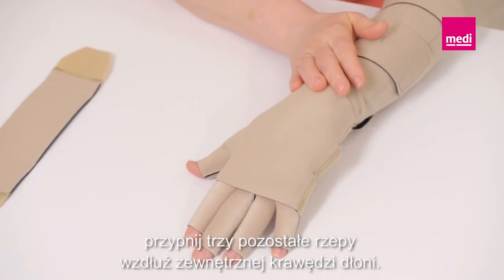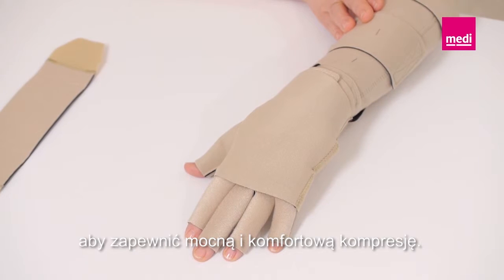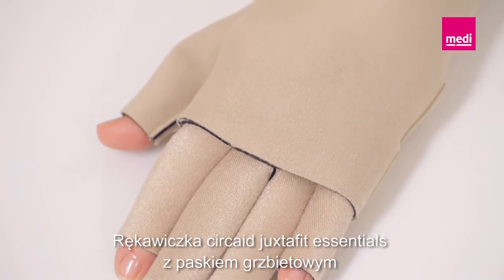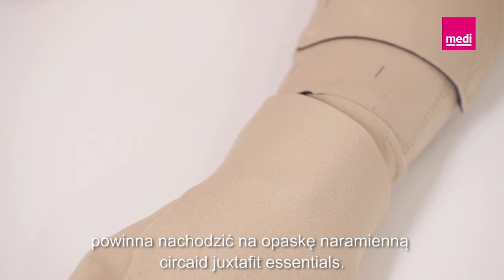Readjust the strap as necessary throughout the day to maintain a firm and comfortable level of compression. The Circade Juxtafit Essentials glove with dorsum strap should overlap with the Circade Juxtafit Essentials arm.